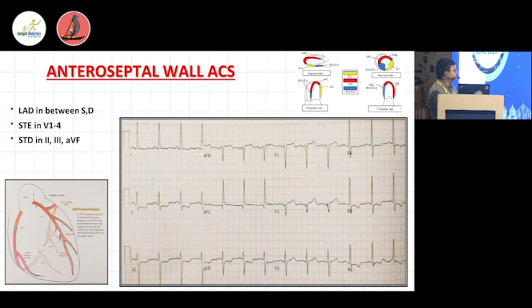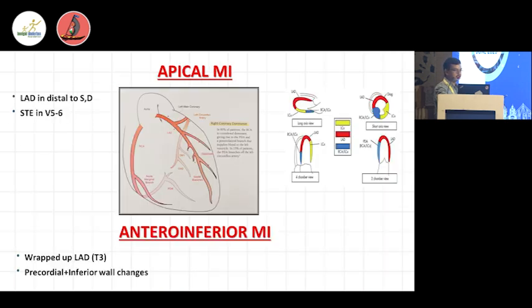It's also important to know about the posterior leads, which reflect the posterior part of the left ventricle. These are the 7th, 8th, and 9th leads, at the same level as V5 and V6. V6 is located at the level of the mid-axillary line, V7 is in the posterior axillary line, V8 is at the scapular line, and V9 is between the spine and lead 8.